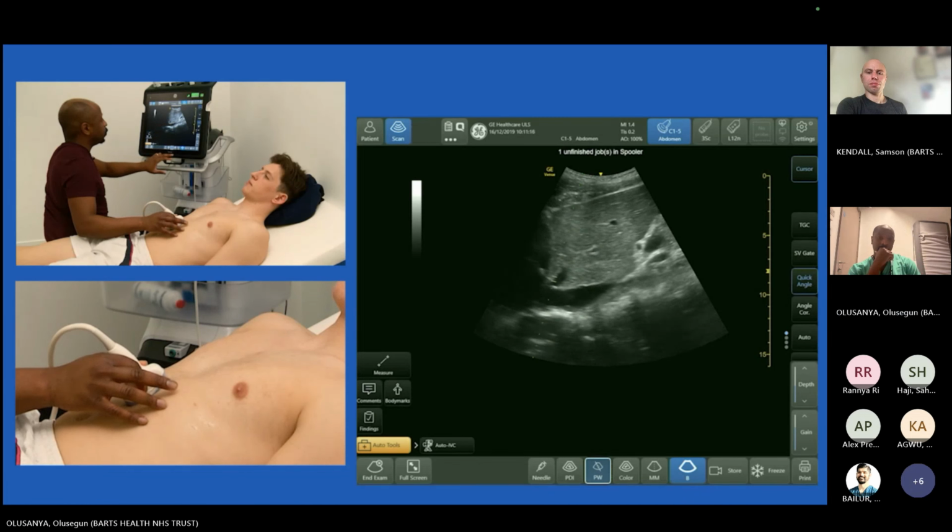The next bit to move on to when scanning for venous congestion is the portal vein. Portal vein is relatively easy to find. You can find the portal vein from multiple windows. There's a subxiphoid window, which can be found by making the probe marker point towards the patient's right shoulder, and pointing it just underneath the xiphoid process, usually about 3 or 4 centimeters away. They call this the X-4 technique. About 3 or 4 centimeters away from the xiphisternum, find a nice view of the portal vein.